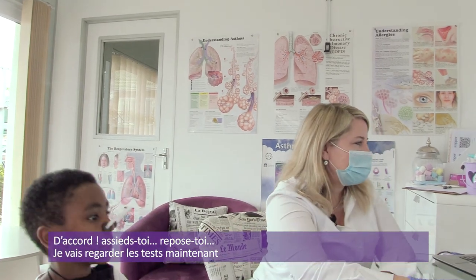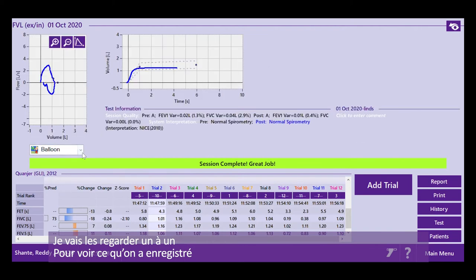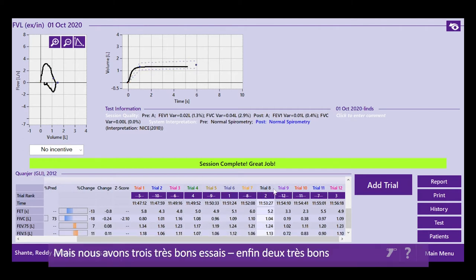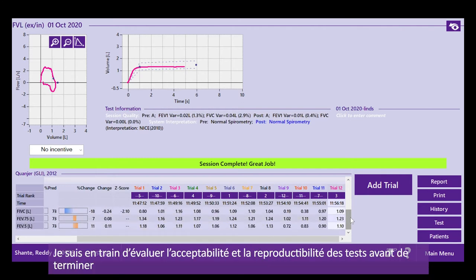Let me look through the tests now. So I'll just look at them one by one to see what we're looking at. Okay, so all of these have failed on the back extrapolated volume and the peak expiratory flow time. But we do have three very good blows, well, two very good blows. Just having a quick look.